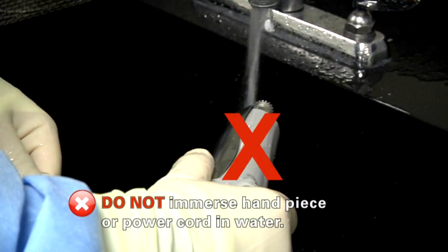Do not immerse the entire handpiece and power cord under water or any solution for any period of time.